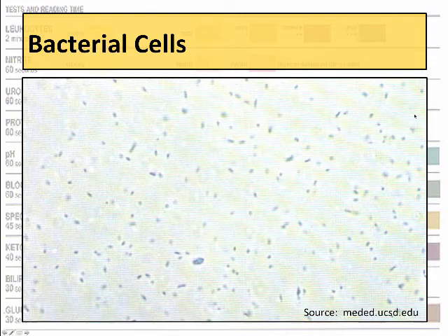Obviously, they're going to be very numerous in cases where you have a urinary tract infection. And they can have multiple shapes. You might have rods, you might have little spheres. Rods are bacilli, spheres are cocci, and sometimes in certain STIs, for example, gonorrhea, you might see them. So it's definitely important to note if you see bacteria.